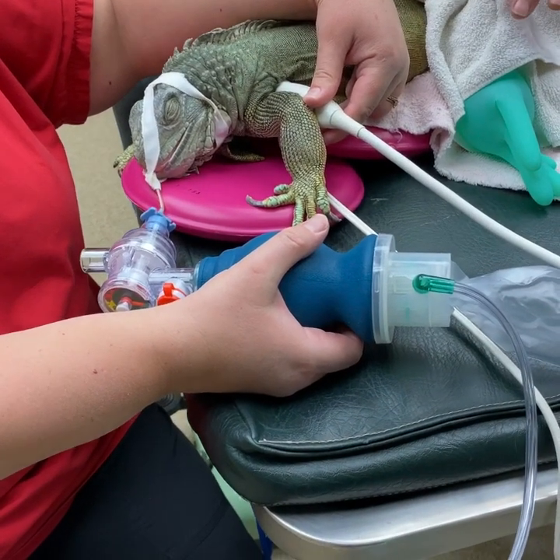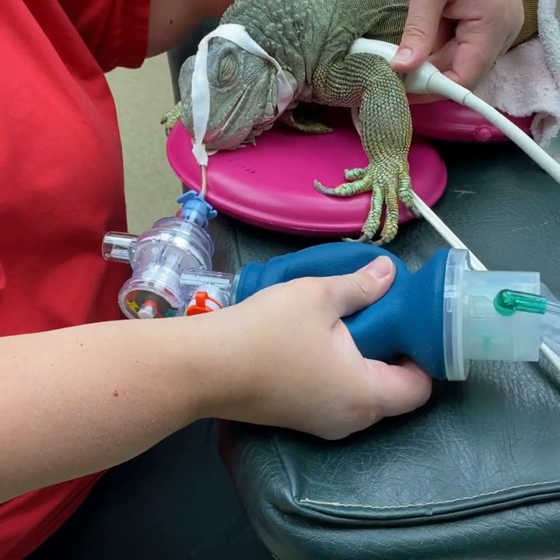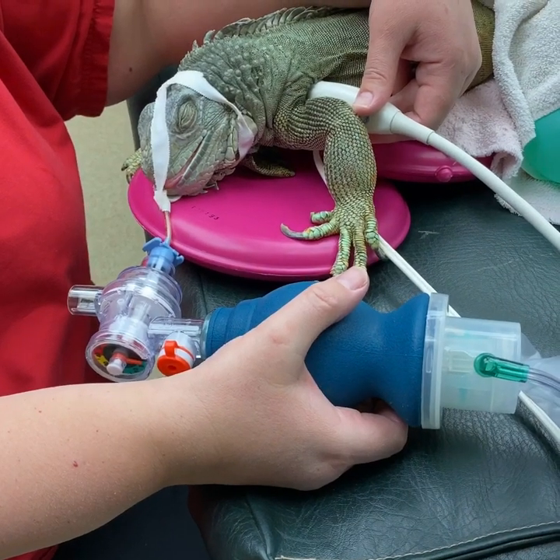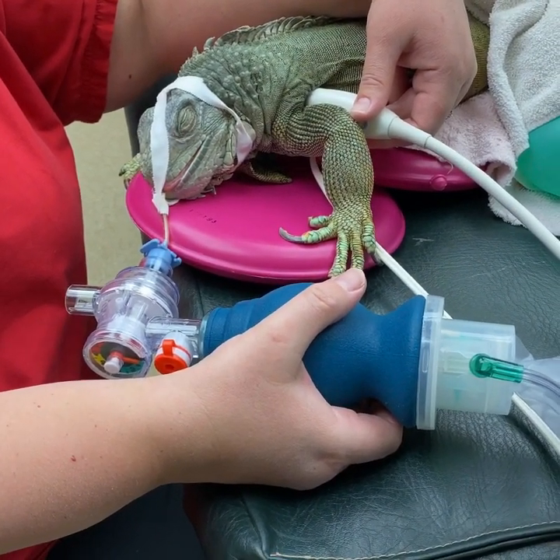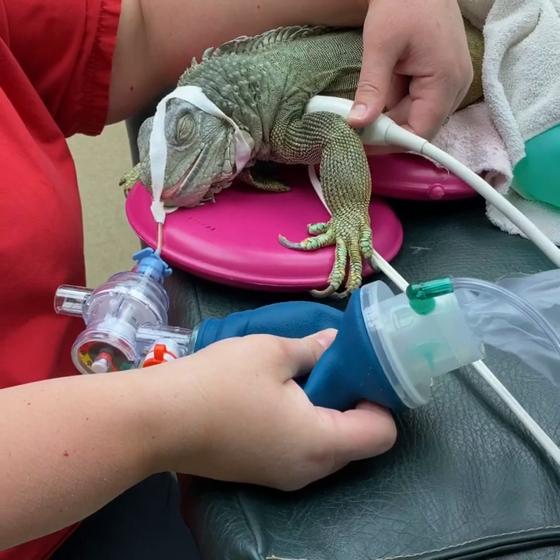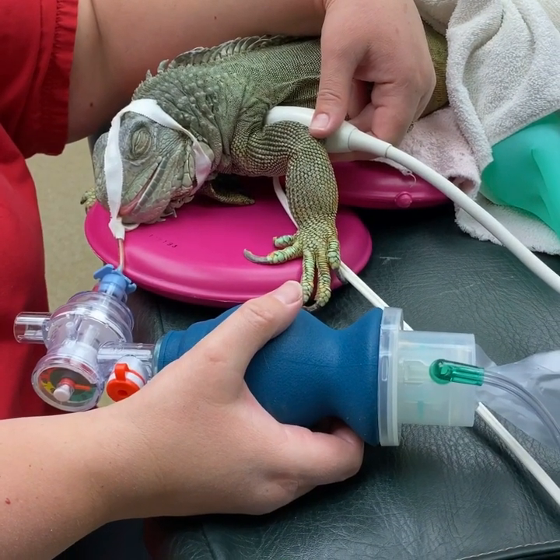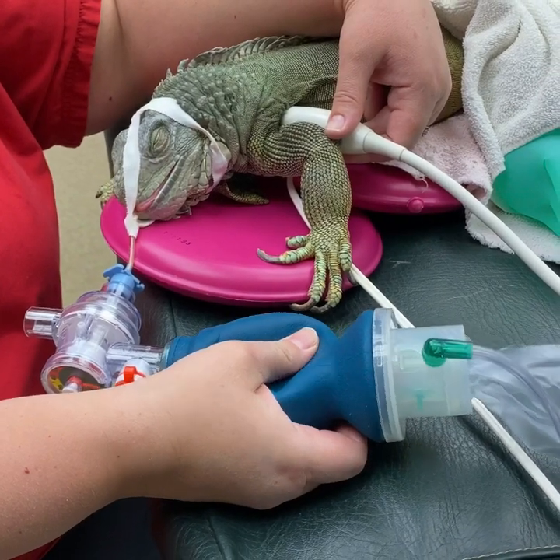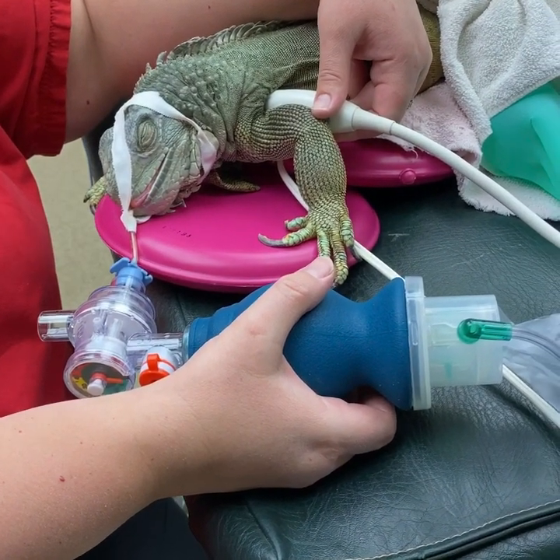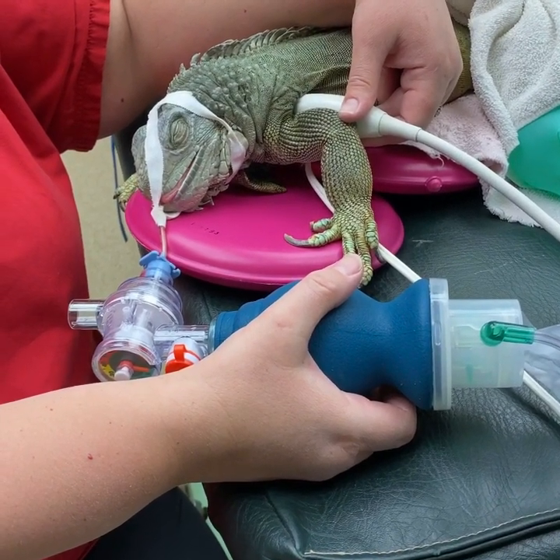As mentioned, we take them off oxygen very soon after surgery is over and breathe room air for them, because room air has a lower oxygen content than 100% oxygen and their impetus to breathe is oxygen content in the blood — so we want to lower that to get them breathing on their own as soon as possible. We continue to monitor with ultrasound to watch the heart and it's doing great. We do have a pulse ox in the cloaca, however it is not consistently picking up, so we rely on the ultrasound probe because it's much easier to see the heart.